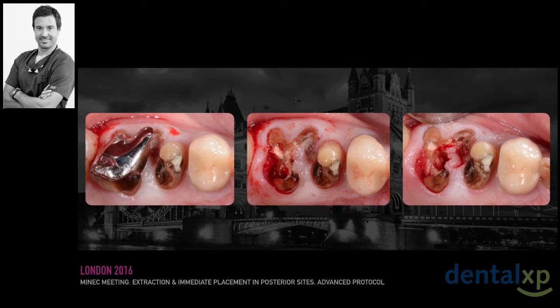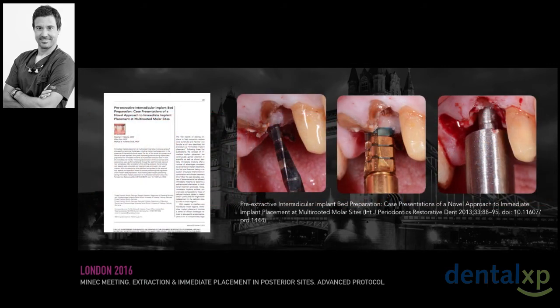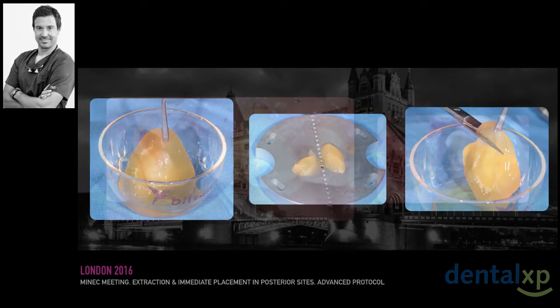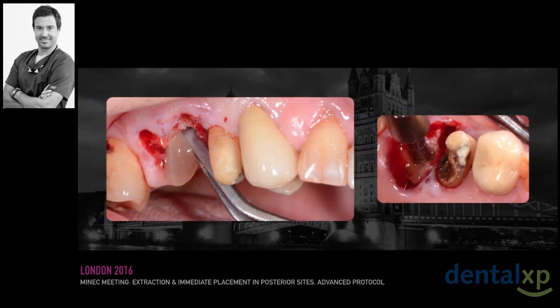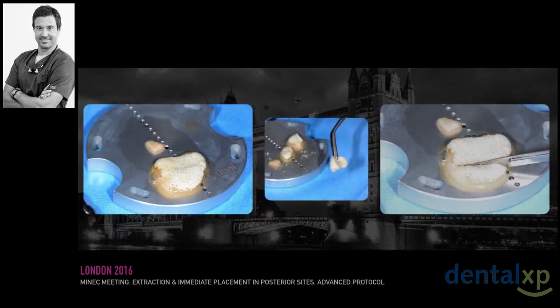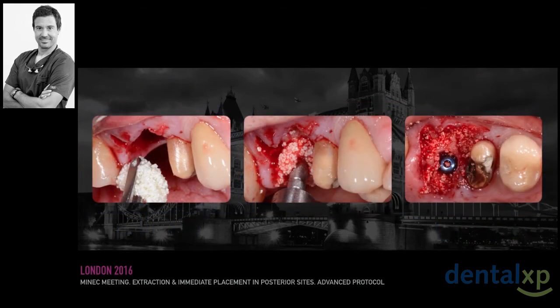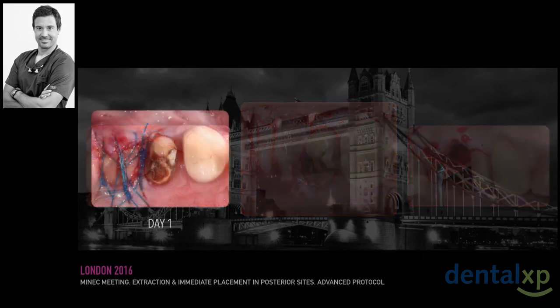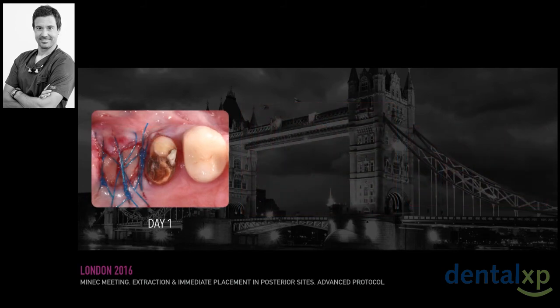We decoronated the molar, started the drilling, and following the paper from Markus Hürzeler, we fractured the floor of the sinus atraumatically after the tooth extraction, taking fraction 2 of our PRGF and placing it into the sinus just in case we tore the membrane accidentally. PRGF into the sinus is a safe and recommended procedure in case of tearing the membrane. We all know that. So the implant was placed into position, and the mix of PRGF fraction 2 with our bone graft was packed into the sockets, as you can see. Membranes fabricated out of fraction 1 were placed on top of the graft to keep the particles in place, and crisscross sutures were placed to finish the procedure.